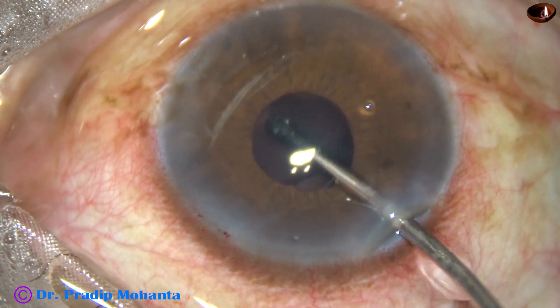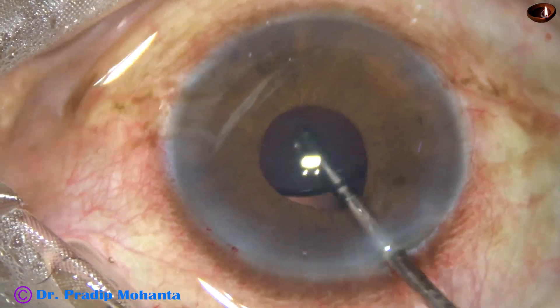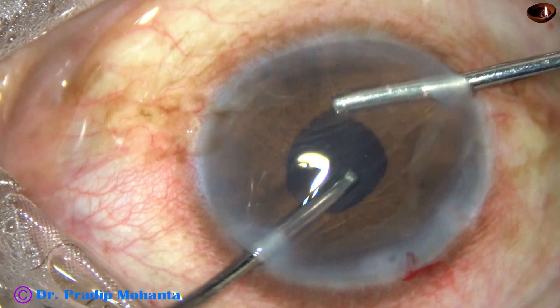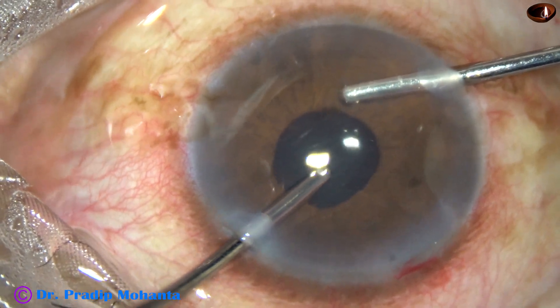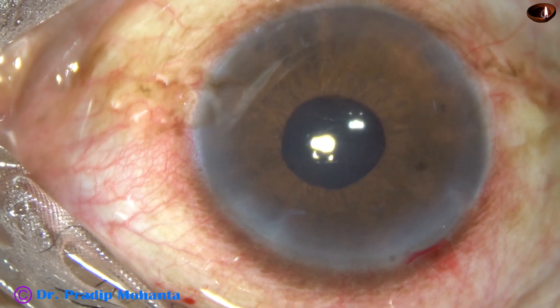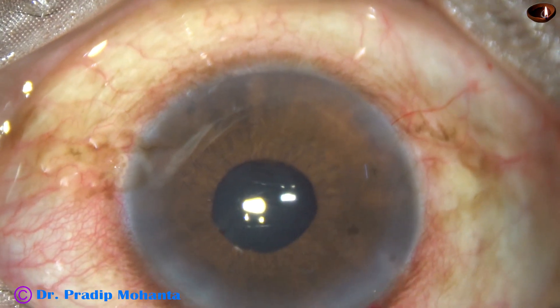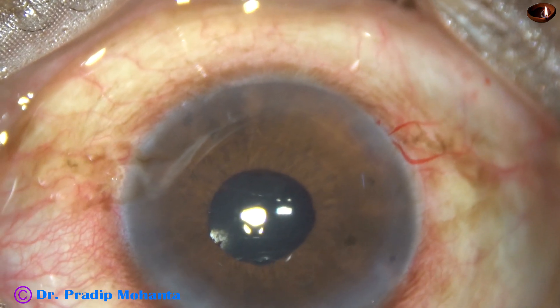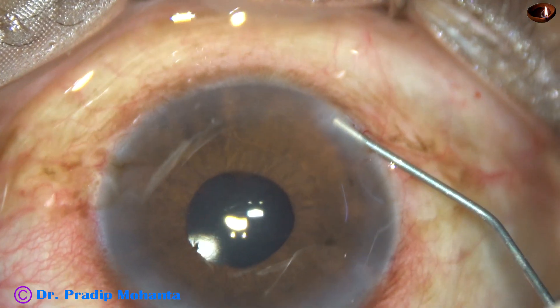Now the visco that is in the capsular bag, as well as in the anterior chamber and the anterior chamber angle, all the visco is removed by Simcoe as well as bimanual irrigation aspiration. And now some moxifloxacin is used — this is intracameral moxifloxacin. Then the side ports are closed by hydrating the corneal stroma.